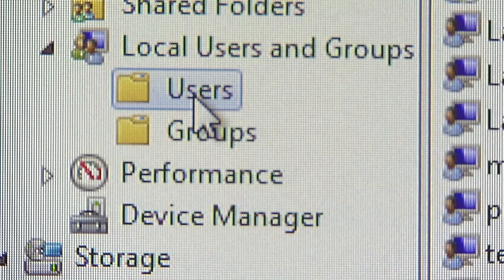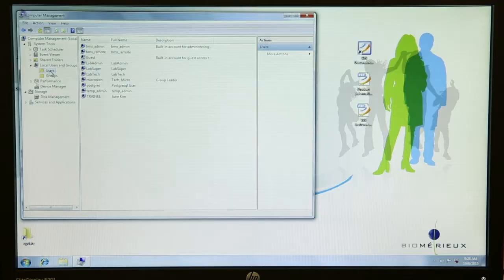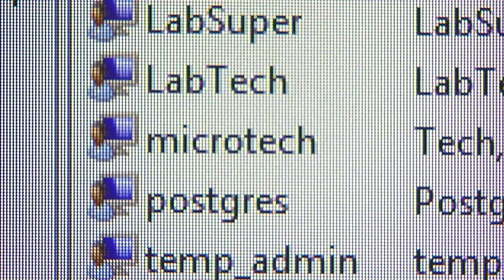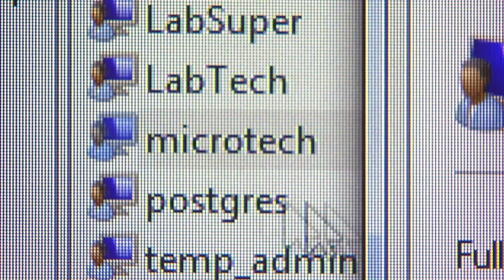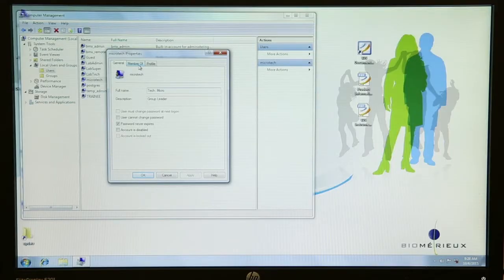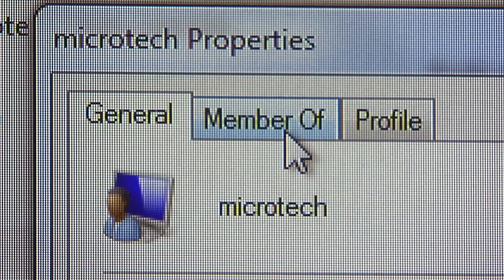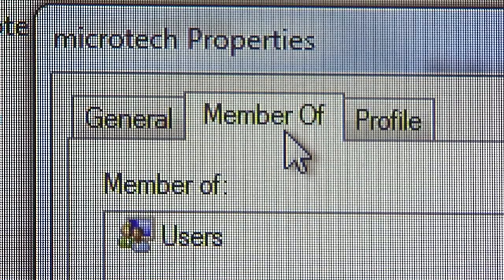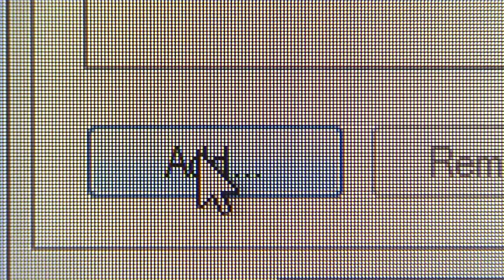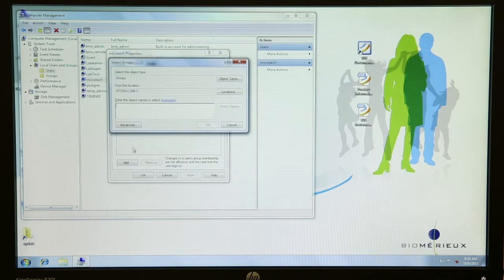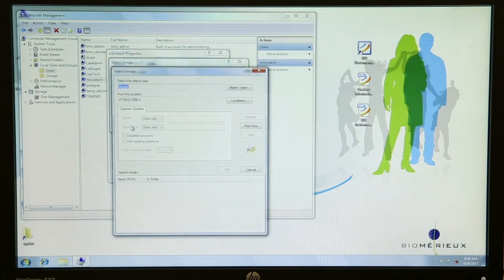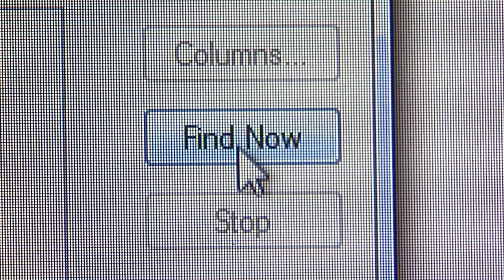Click on the Users folder on the left side of the screen to display the list of all users. Double-click on the newly created username in the right-hand window — in this example, click on Microtech. Select the Member of tab. Click the Add button. Click on the Advanced button in the Select Group window. Click on the Find Now button in the Select Group advanced window.